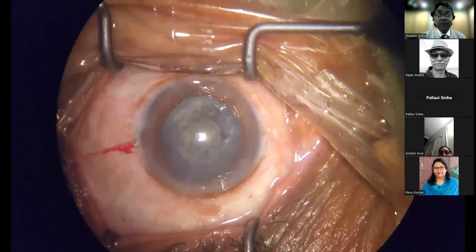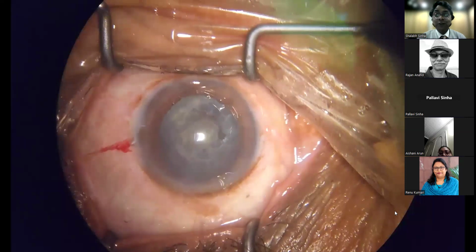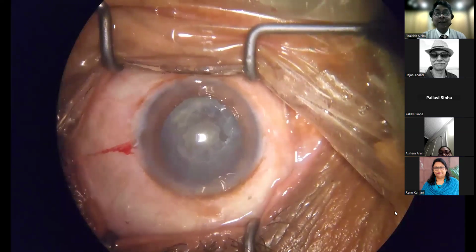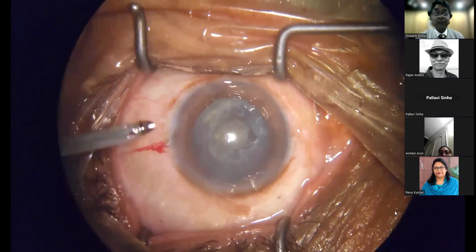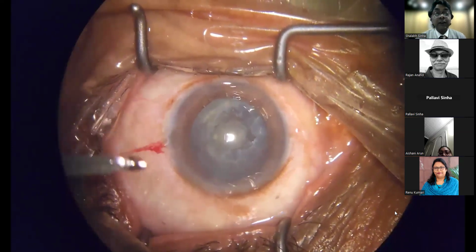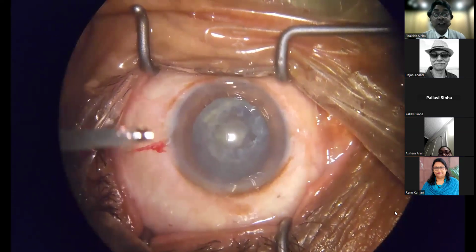So I have a system where if the cassette fills up with water, you need to replace it with a new cassette. So probably that is what had happened here, and I had to come out and allow my assistant to change the cassette.